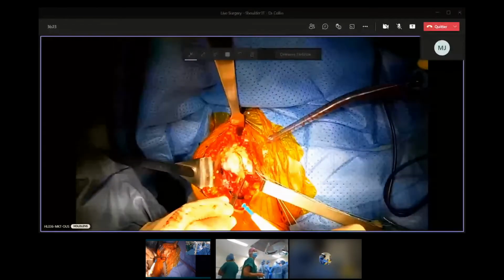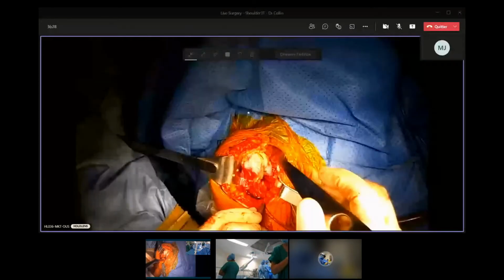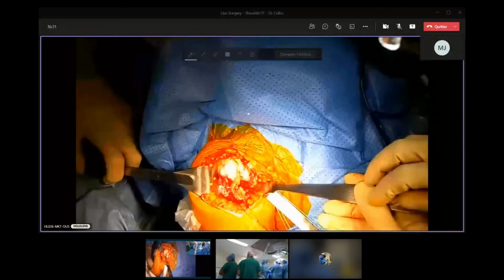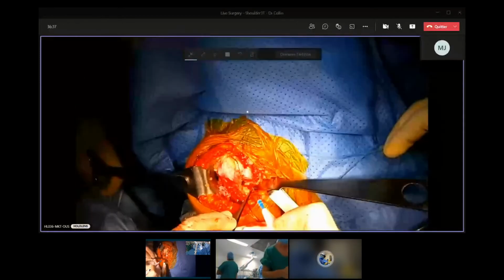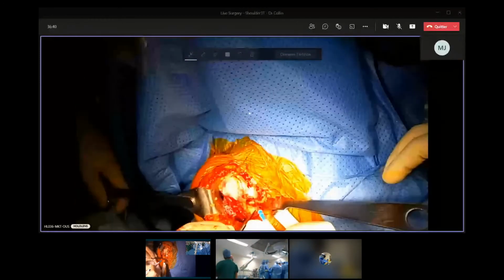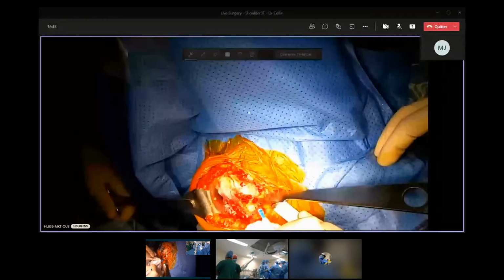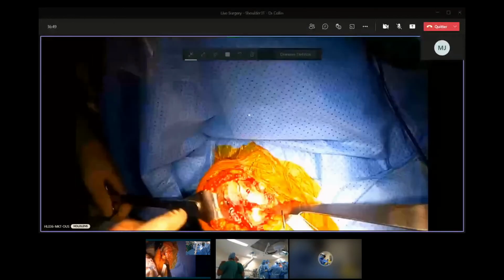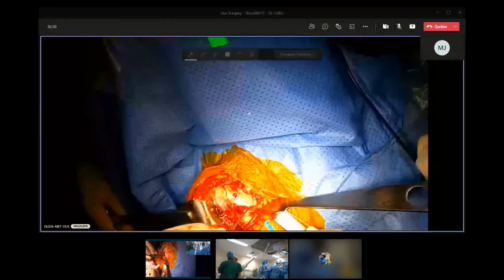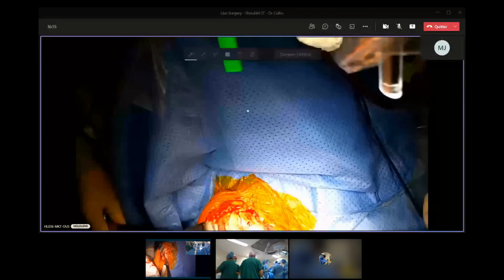So you can take, at this step, the Oman retractor from the superior part to the inferior part here, and you can continue to open your subscap up to, if this is the lat dorsi here, so you need to open it up to the lat dorsi insertion. You make some external rotation, you stay very, very close to the bone, like this. Like this. At this step, you should not dislocate.